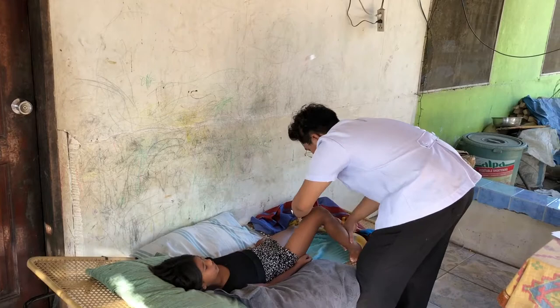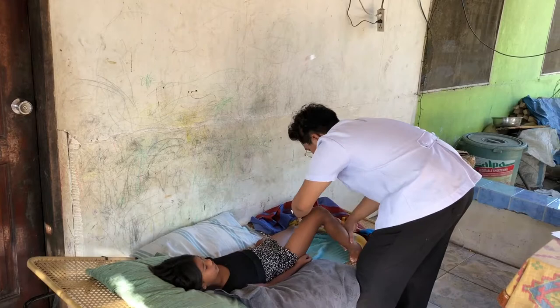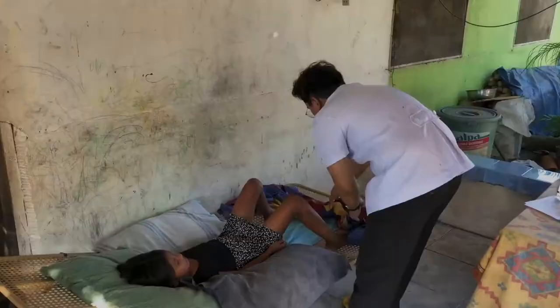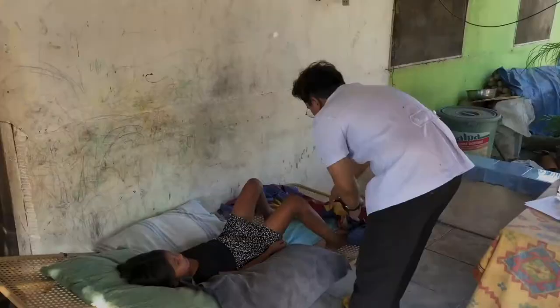Place patient in dorsal recumbent position. Assist patient to side near you. Loosen foot part of the top sheet. Use diagonal draping.